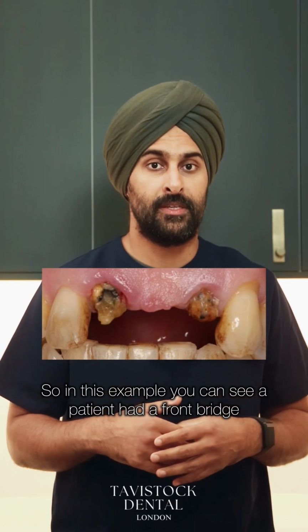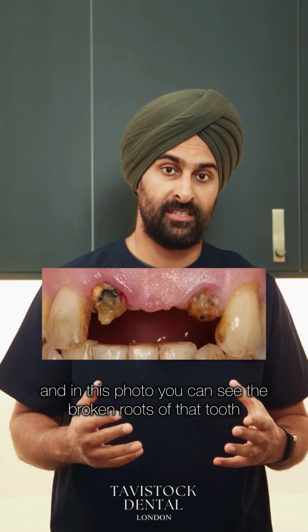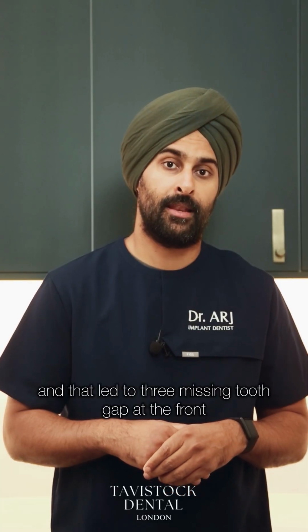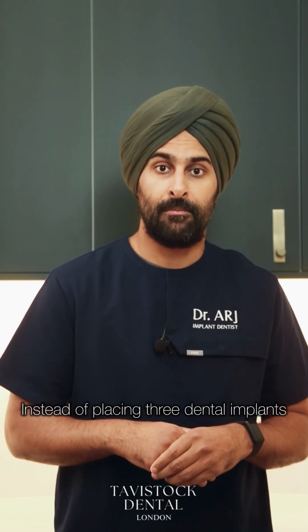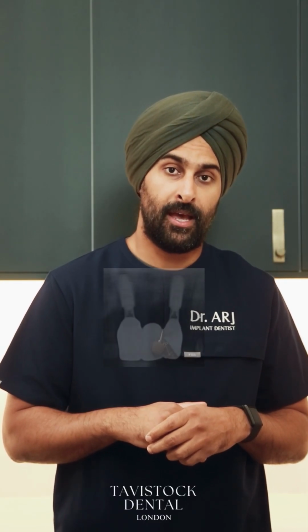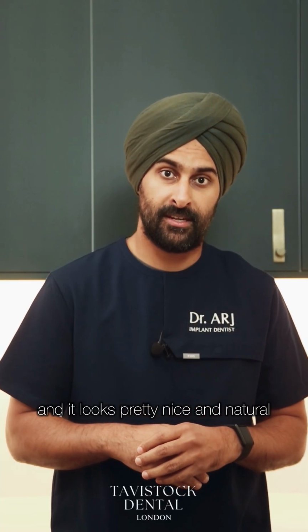In this example, you can see a patient had a front bridge which was supported by their own teeth, which failed, so it broke off, and in this photo you can see the broken roots of that tooth. Nothing could be done to reuse these natural roots, so they had to be removed, and that led to a three missing tooth gap at the front. Instead of placing three dental implants, we've placed an implant at either end of the gap, and we've used an implant bridge that's been fitted over the top. As you can see, when the bridge is fitted, you cannot really tell how many implants are there supporting it, and it looks pretty nice and natural.